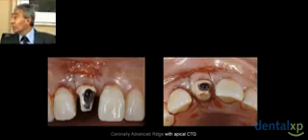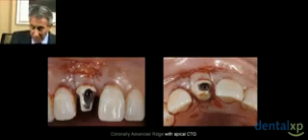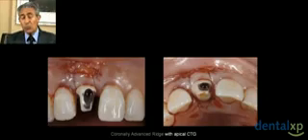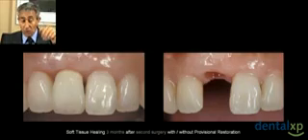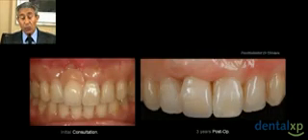by Rosenberg in the 80s, showing that we can move the whole quantity of tissue around that implant by doing a circular incision, by doing a horizontal incision down below the mucogingival line, plugging a new connective tissue graft into that pouch, and then placing vertical suspensory sutures to maintain everything in place, this whole entity of tissue down. And the end result, yes, is nice.